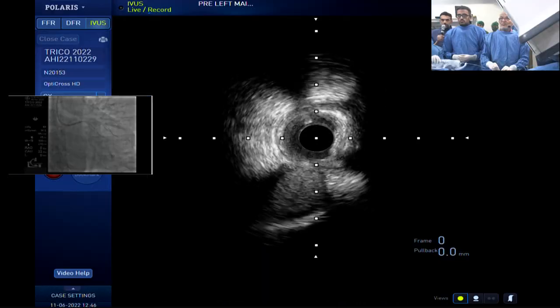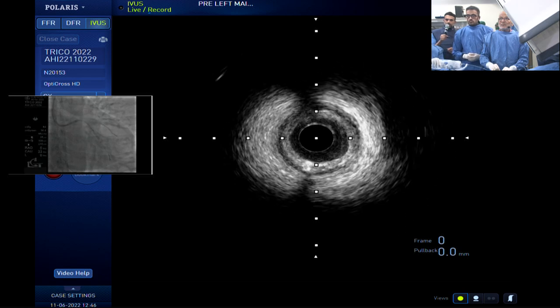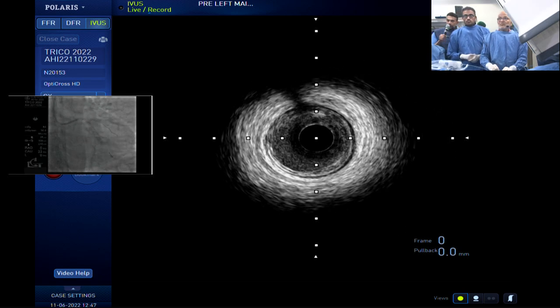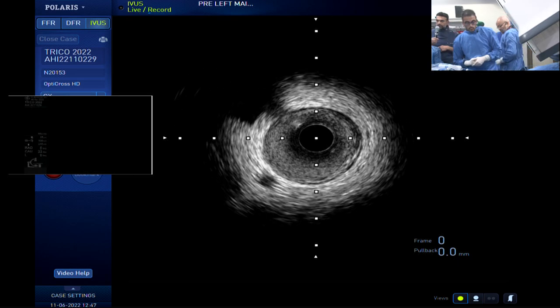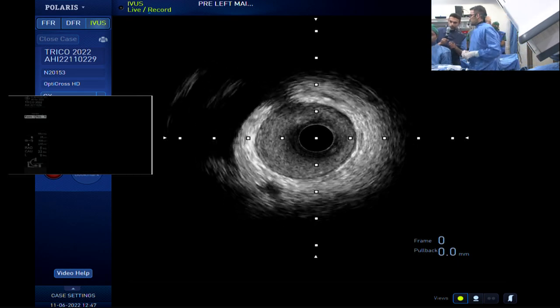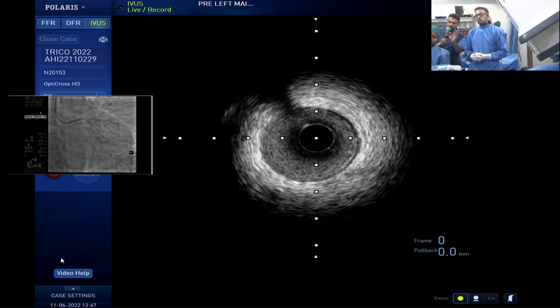So keep coming. There. Okay, this is quite diseased here. I'd come further forward. There. This is getting good. Okay, good. So cine here now. Cine. So we got the distal landing zone. There. So that's your distal landing zone. Okay? And this is the point of our wire skeletonization business.